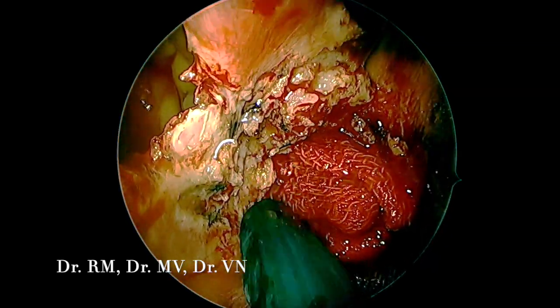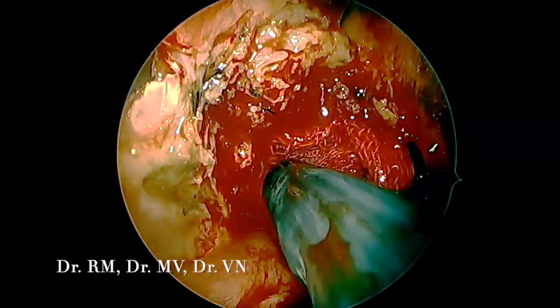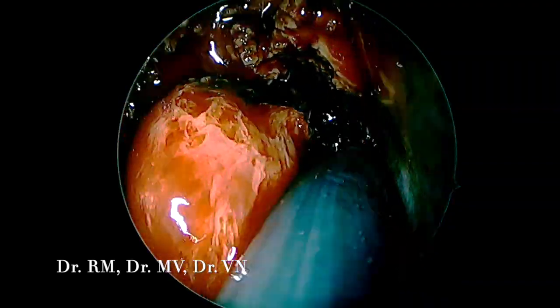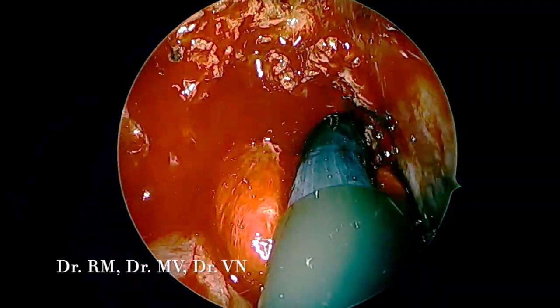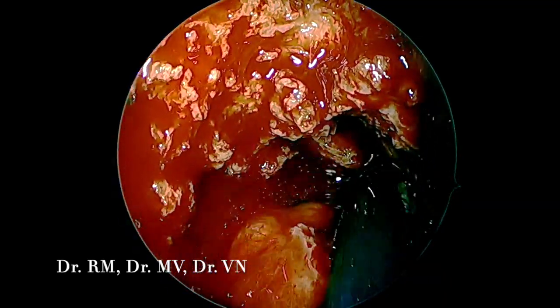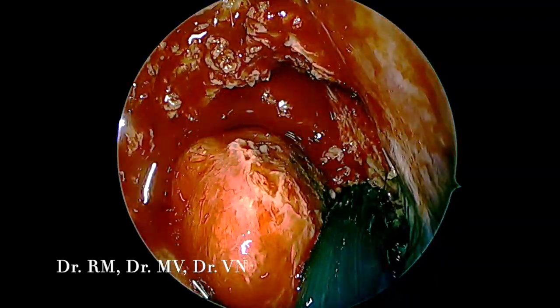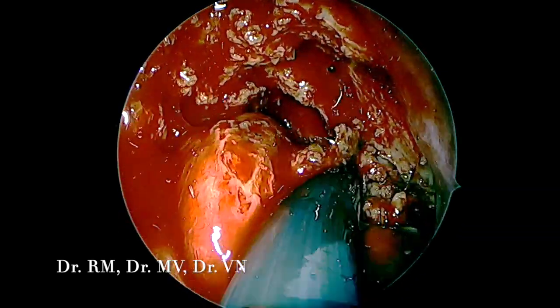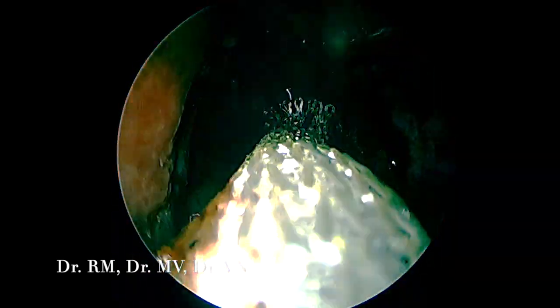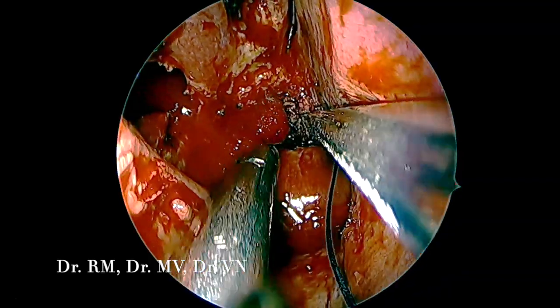By doing the posterior septectomy, we are working with a bimanual technique with two surgeons, four hands. With the gauze, we are pressing the mass posteriorly to the maximum, and there was a little bleeding. As the mass is very vascular, we found a bleed coming from the nasopharynx. So using Surgicel, we are planning to control it. Usually this is controlled by Surgicel or bipolar, a pack of Surgicel, where the gel foam is kept for a while.